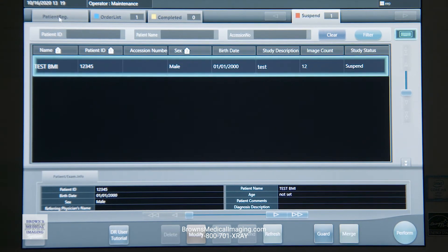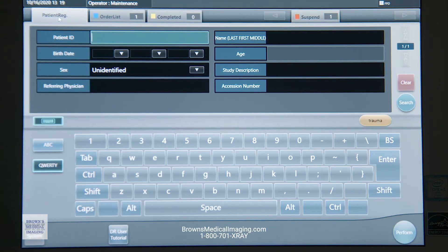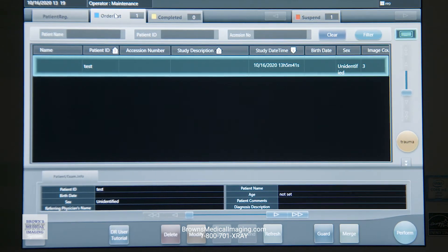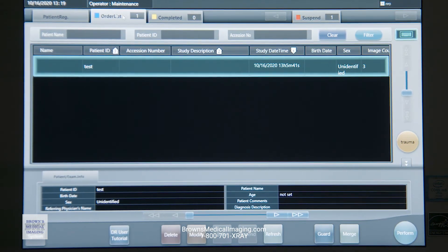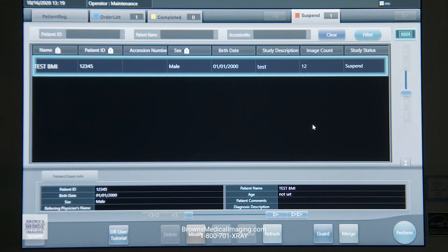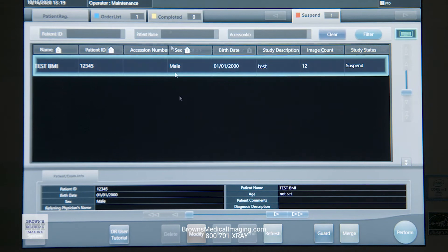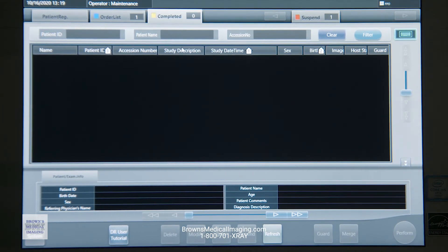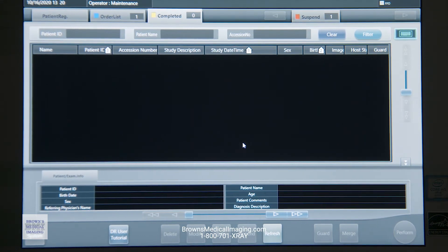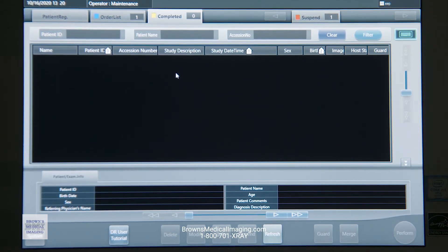We talked about registering your patient manually over here in patient registration. Our order list is where our work list is sitting — that's where we're grabbing our patients. Our suspended list is stuff that's been put on hold. We do have a completed list where any study we've done in the past is going to be sitting. This database does roll off and self-delete — first in, first out — and we can set that at a percentage interval.